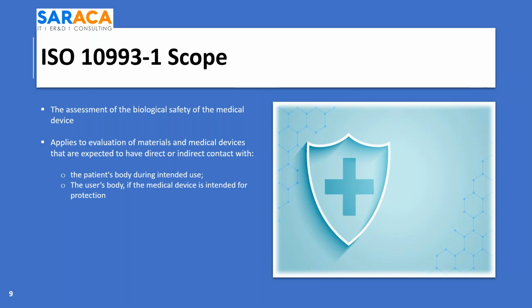This is a question that's come up even during the audits by notified bodies. One auditor was trying to tell me that the skin, or the outside of a laser, which doesn't come in contact with the patient during use, needed to be tested for biocompatibility. But that's only if you're going to wear the laser as a mask, as indicated here. And this is a direct quote from the standard. This means if the medical device is going to be worn as a face mask, gloves, operating gown, covers, anything that protects the operator, that's intended for protection of the operator, needs to be biocompatible. But if it's not used for protection, it does not.